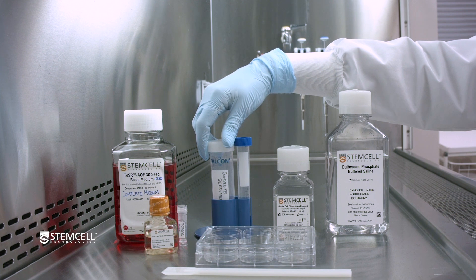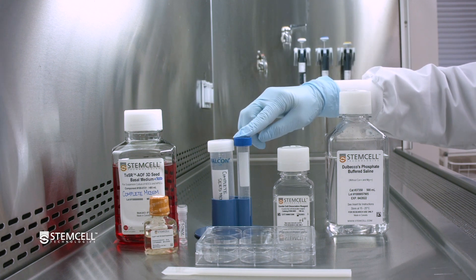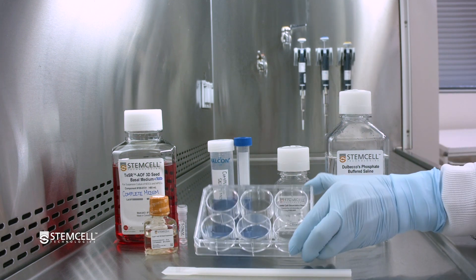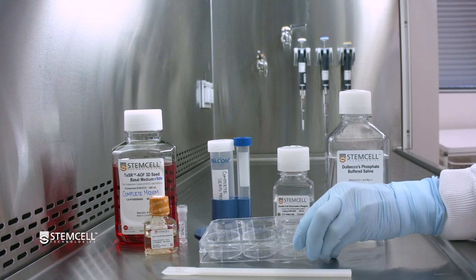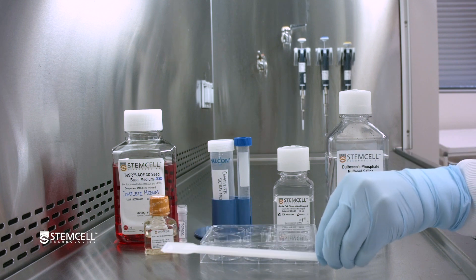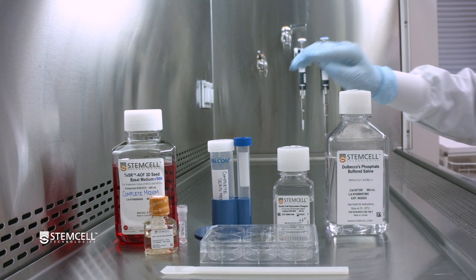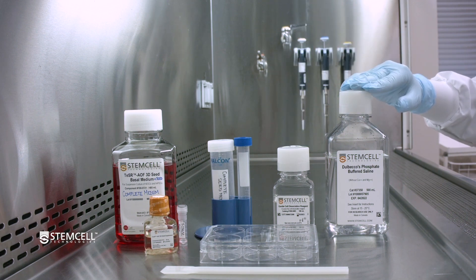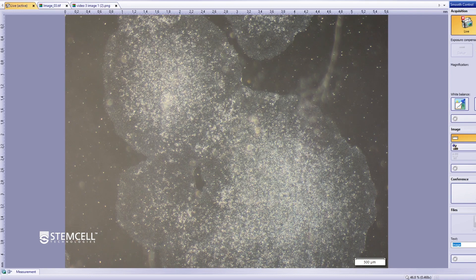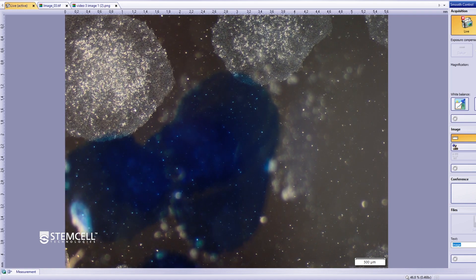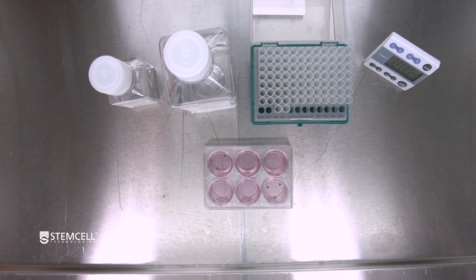Also set out the remaining required materials. Use a microscope to visually identify the regions of differentiation and prepare D-PBS without calcium and magnesium. Use a microscope to visually identify the regions of differentiation and mark them with a felt tip or lens marker on the bottom of the plate. Once all materials are prepared, begin the passage.